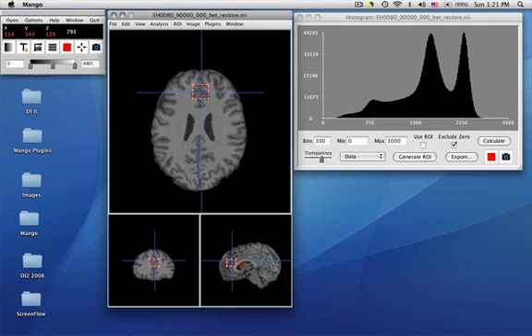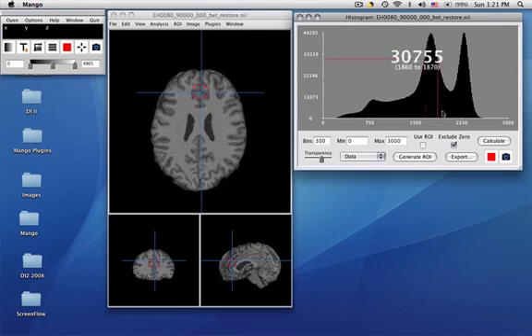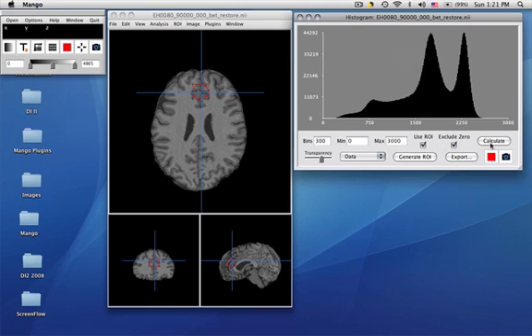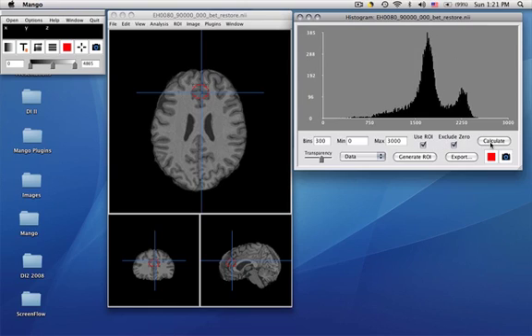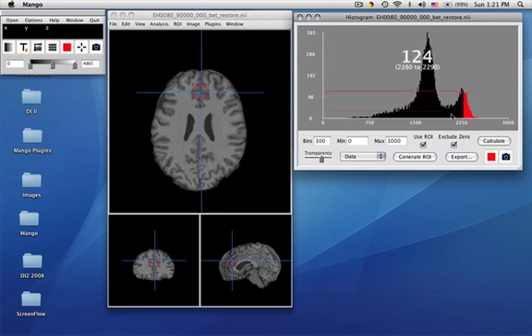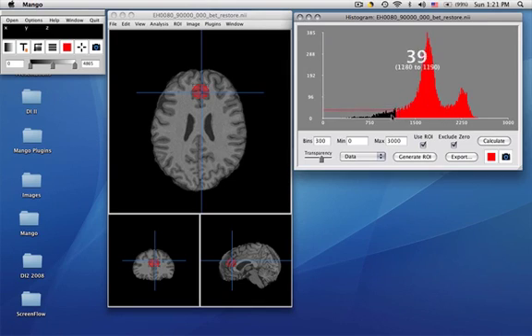You can see it's spherical in these three views. And now when we go to the histogram and we say use ROI and calculate, it calculates very quickly. Now we're calculating a small number of voxels. In this case, it's mostly if we highlight white matter, gray matter, and then some CSF.